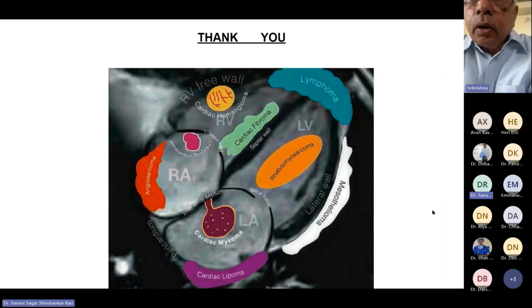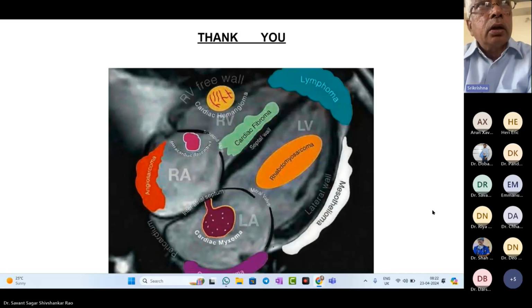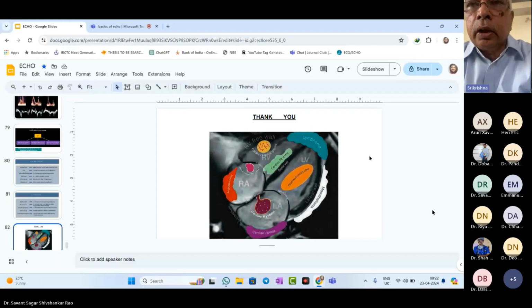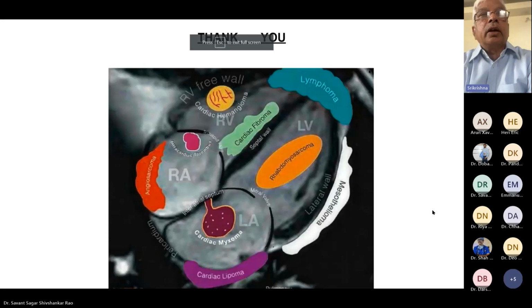Good. Thank you, sir. It was quite an extensive treatise on echo, but more importantly, I want all of you to see these echoes being done in person, especially in the ICU: how to diagnose cardiac tamponade, how to see the volume status of the patient, and what the diastolic function and systolic function are post cardiac surgery.